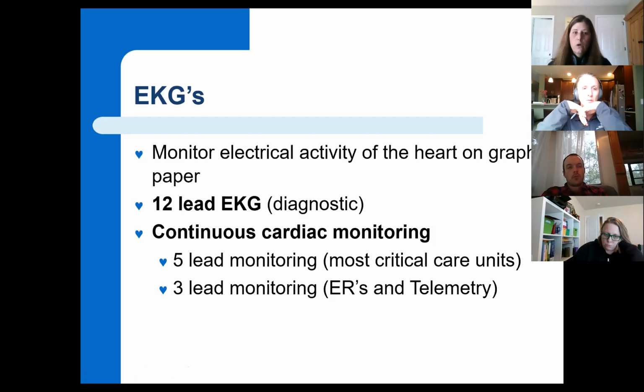Now, there's also continuous cardiac monitoring that will give us an EKG strip. If you work in the emergency department, a telemetry unit, an intensive care unit, any of you that were in clinical with me in 101, way back in 101, that were out at 3 Tower Pineville, our patients had 3 leads on them there. Everybody on that unit had to have a telemonitor on.